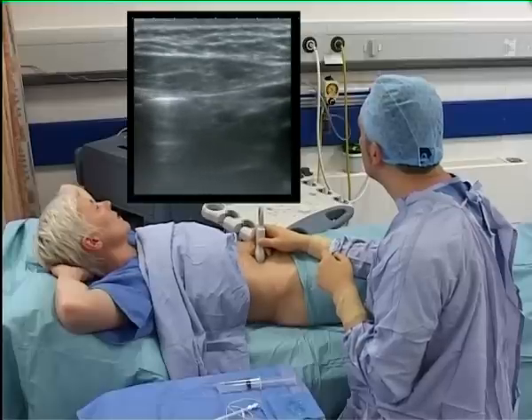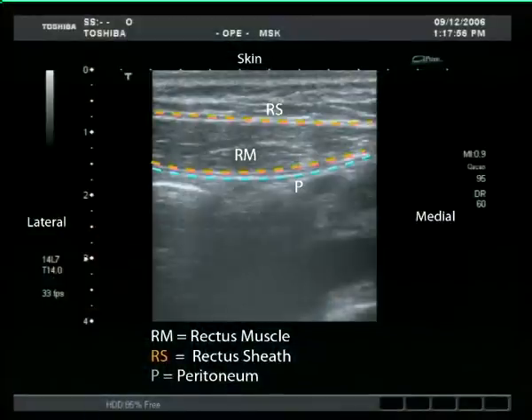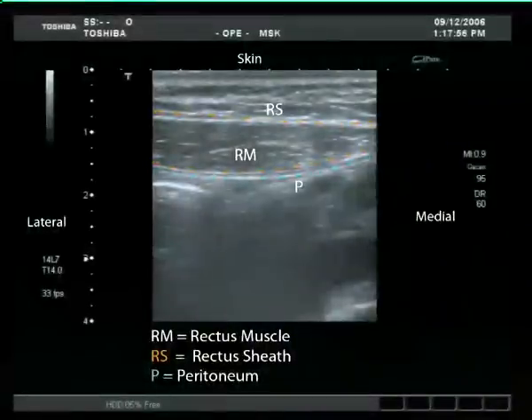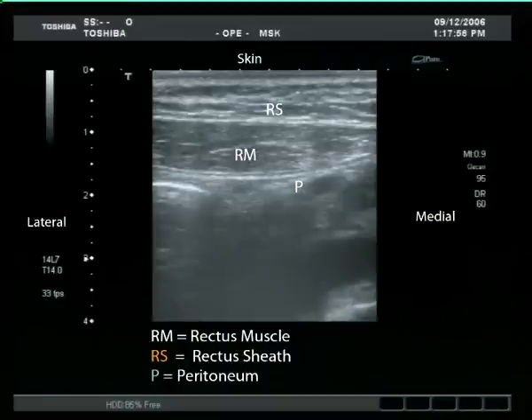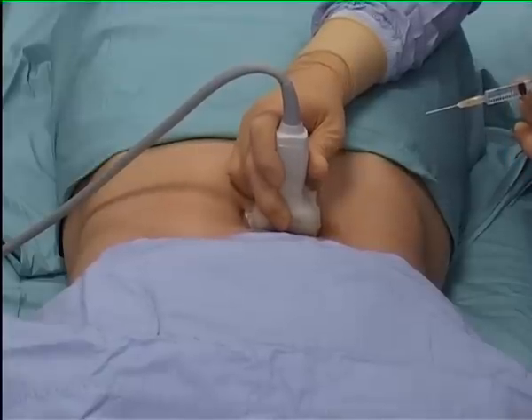Let's get started. The rectus muscle and its enveloping sheath are identified at the level of the umbilicus. Skin infiltration is administered.